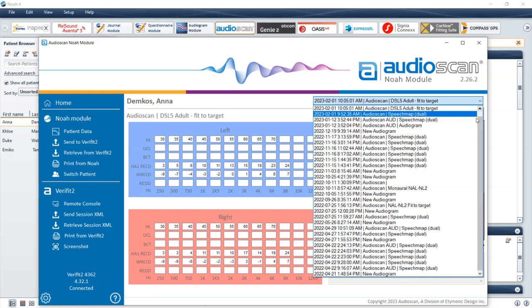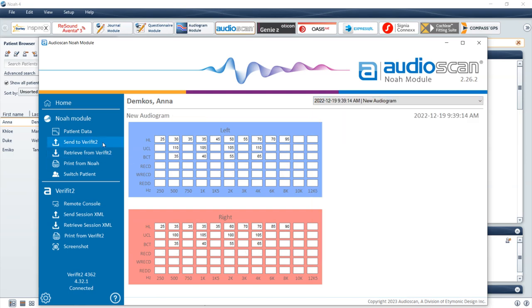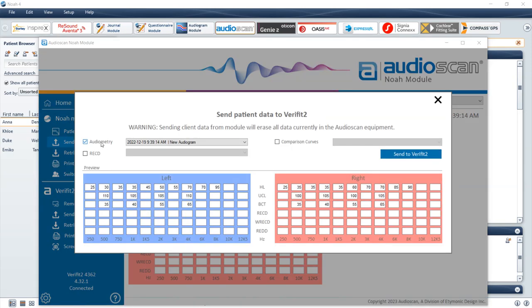To transfer data from the AudioScan NOAA module to AudioScan products, select the data to be transferred from the Client Session list so that it is highlighted in blue. Select Send to Verifit 2 to send the data to the AudioScan device. A preview window will display indicating which data has been selected for transfer. To modify which data will be sent, select or deselect the checkboxes for audiometry, RECD, or comparison curves.